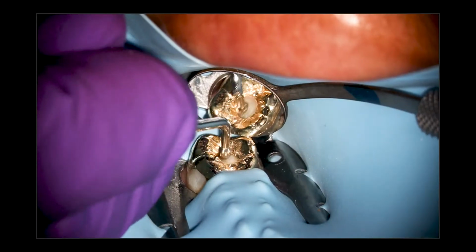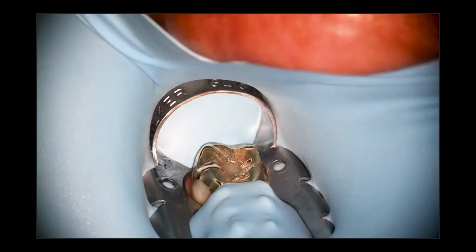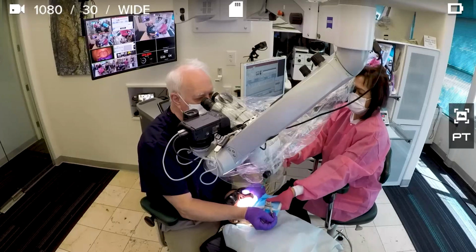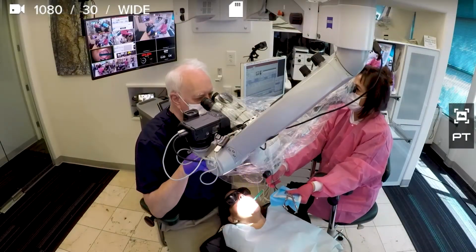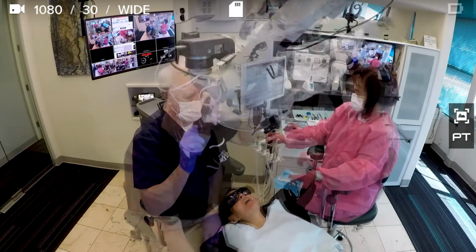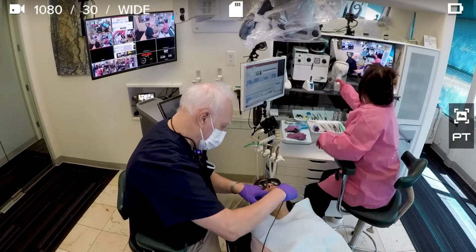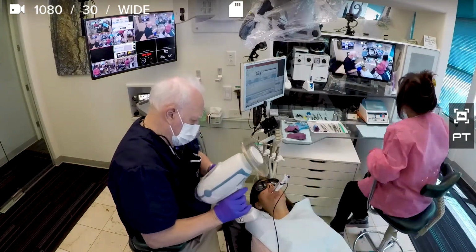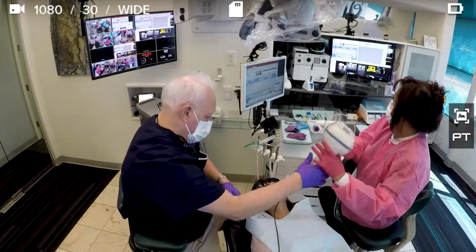So let's take it from the moment you complete a case. Here we are putting the final restoration in a case we've just completed. We take the dam off. And now we have to go about generating the report, all the things necessary to do. The first thing is you need to take a final radiograph, because that needs to go into the final report. So you ergonomically take the final radiograph.